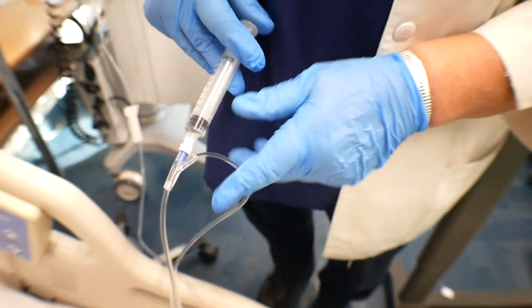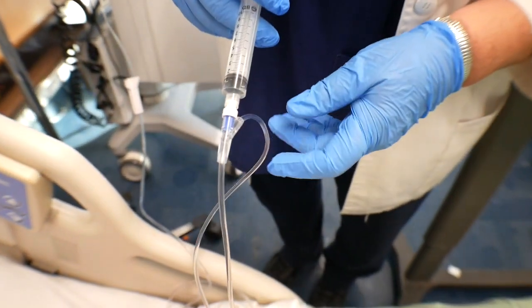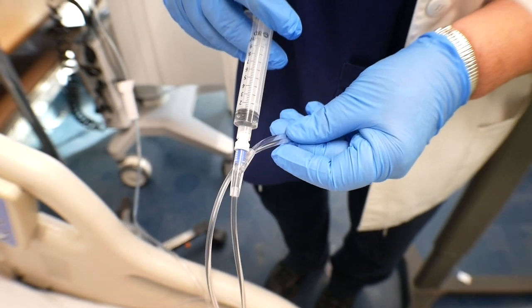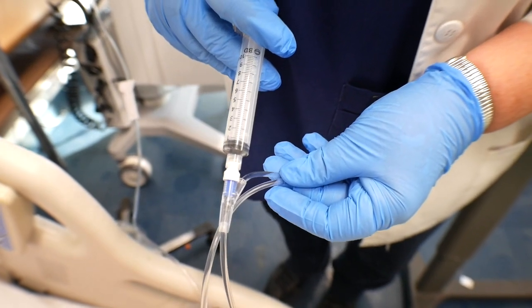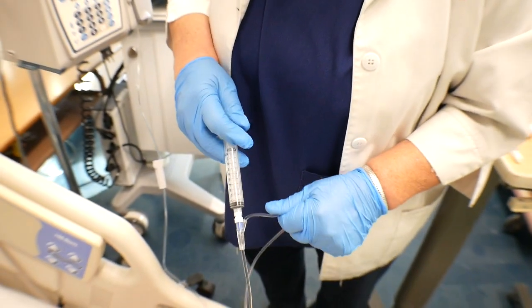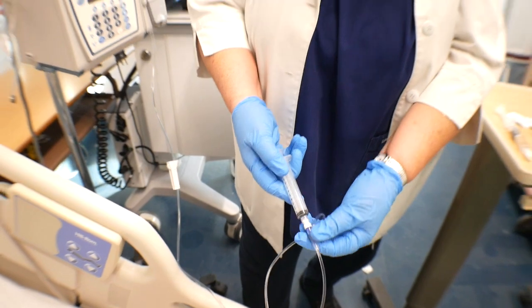Now open it up, and since it beeped, I want to restart it. Then the last count, 10 seconds clamped and 5 unclamped.